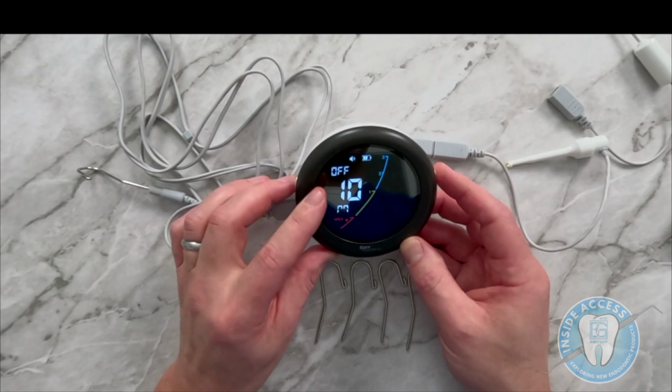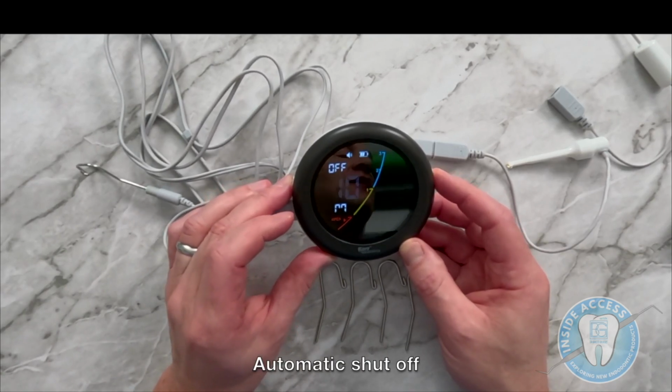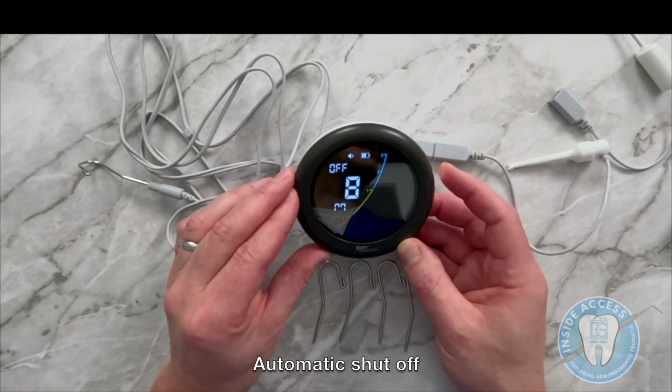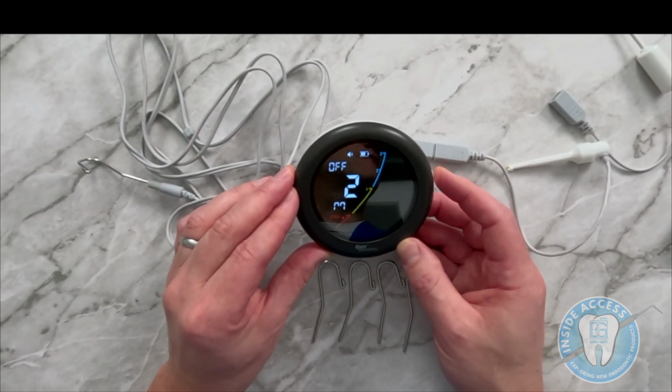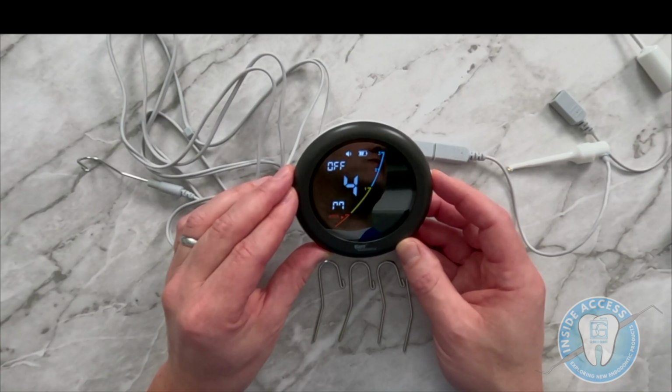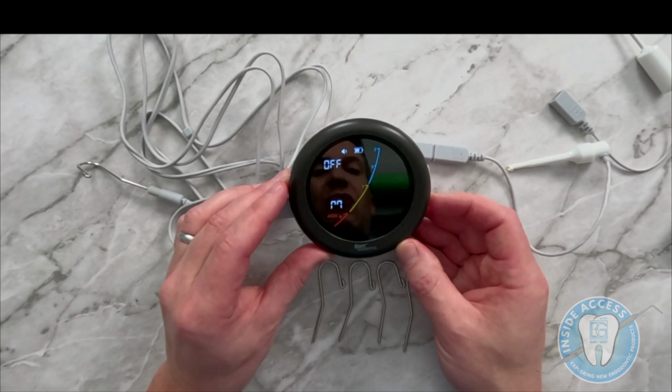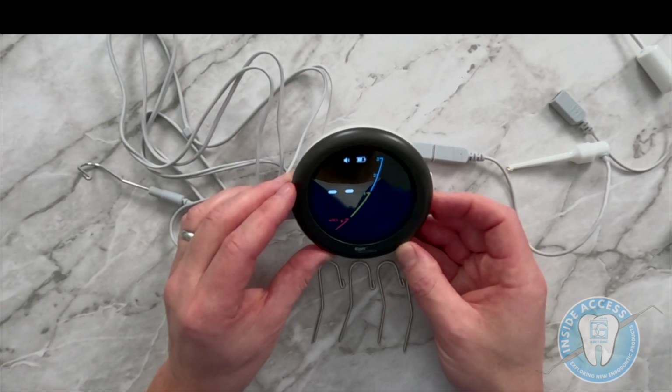The next one is the off. This is going to be the automatic shut off. It can be 2 minutes, 4 minutes, 6 minutes, 8 minutes, 10 minutes. So for me, truthfully, if I haven't used it in 2 or 4 minutes, that's going to be perfect so I can conserve the battery. And again, this is rechargeable. So when I hit the settings again, we're ready to go.